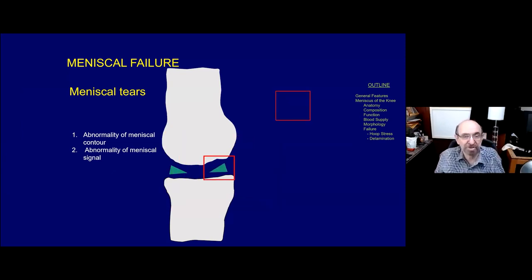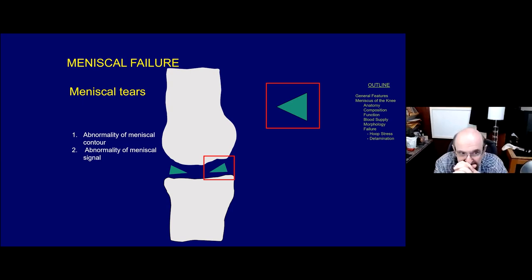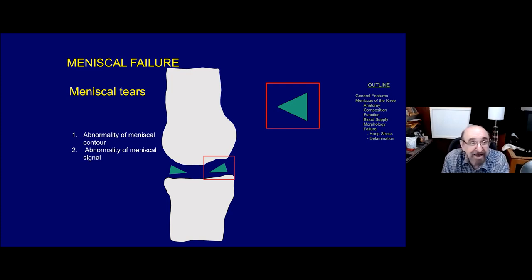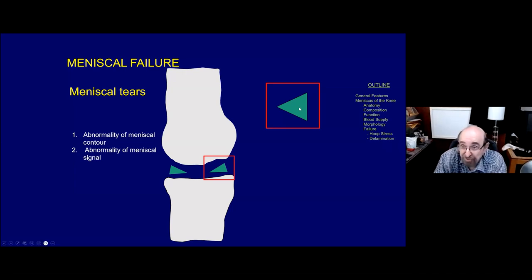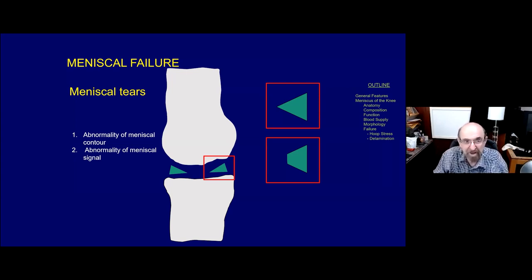As radiologists, it's our job to diagnose meniscal tears. There are two classic MR findings of a meniscal tear: an abnormality of meniscal contour, and an abnormality of meniscal signal. The normal meniscus tends to be smooth and triangular of generally low signal. The first alteration we look for is an abnormality of meniscal contour - it can be truncated or irregular. Any of those findings represent an abnormality of meniscal contour.